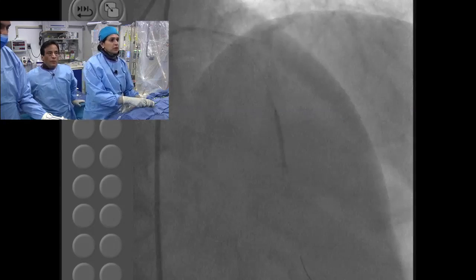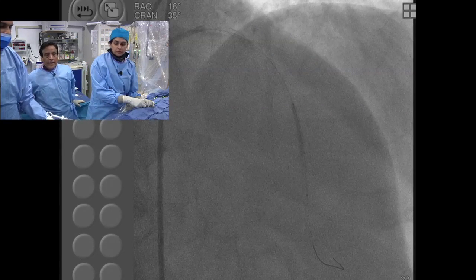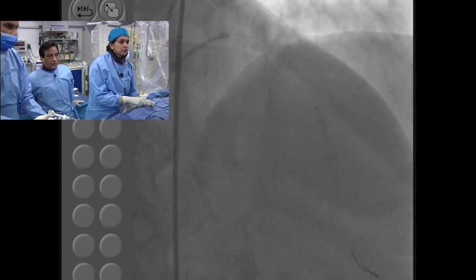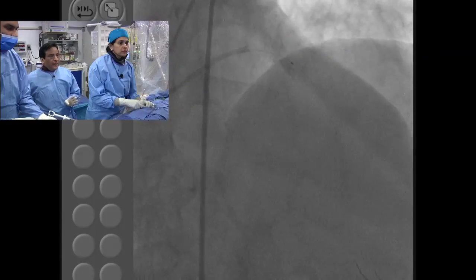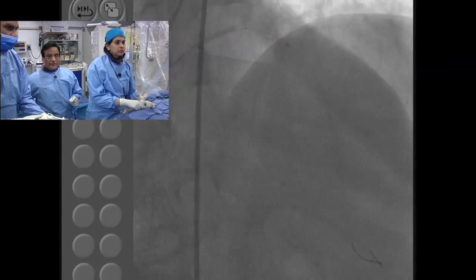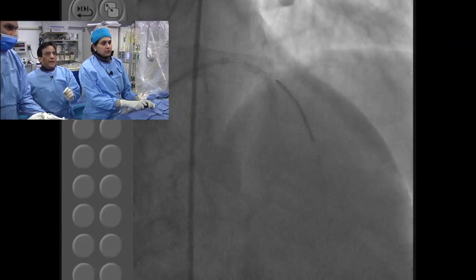Key is overall rotational atherectomy in the country: of the 800 plus thousand PCIs done, it's used in 1.8 to 1.9% of cases, which means less than 2%. You could do it here. Okay. Now, why is that, while heavily calcific lesions are present in about 8 to 9% of cases? This gap. Probably even more, no?